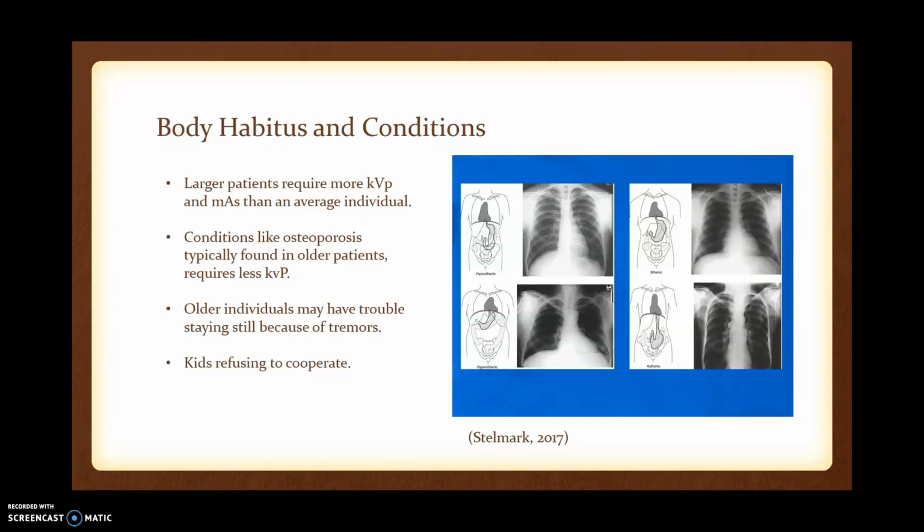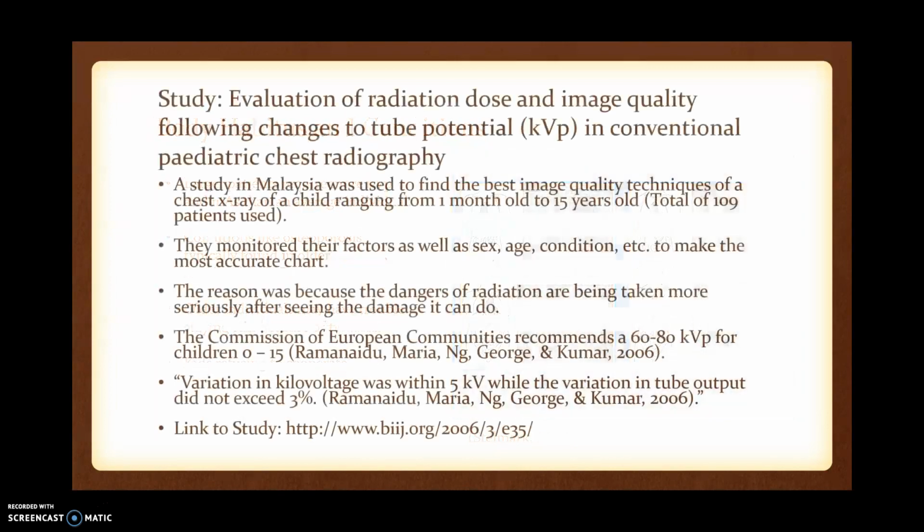Same thing for kids. Some kids do not want to cooperate, and you have to resort to using a lower mAs. I mean, their bodies are tinier as well, but that's kind of another point.